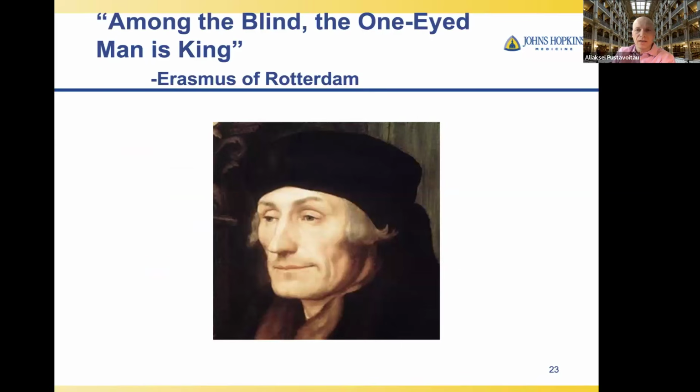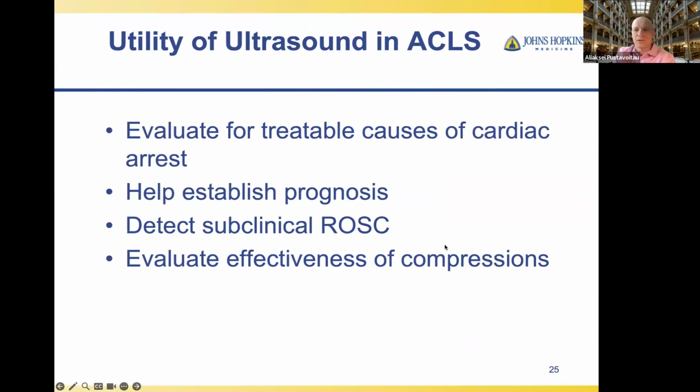There's that saying, among the blind, the one-eyed man is king, right? Ultrasound provides you with that eye, so you can actually see what happens. So how can it be used? It is used to evaluate for treatable causes of cardiac arrest and help establish prognosis.